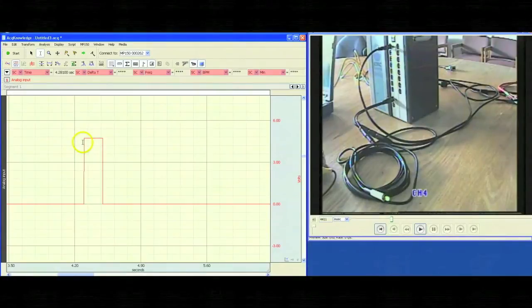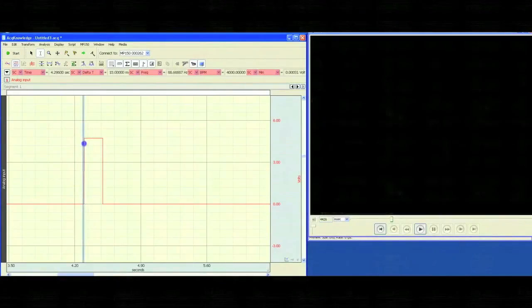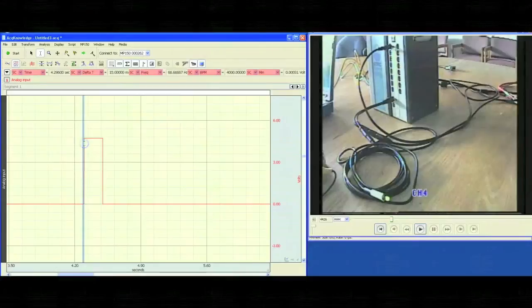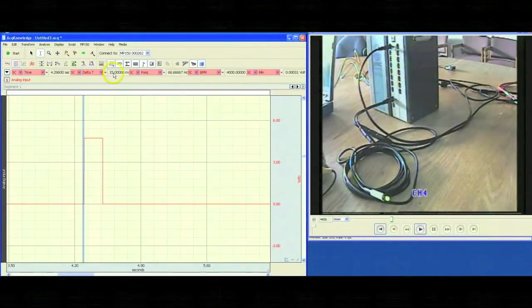So, what we can do is highlight from the point we're at to the point where our peak starts, and take a look at that delay. Right now, it's about 15 milliseconds.